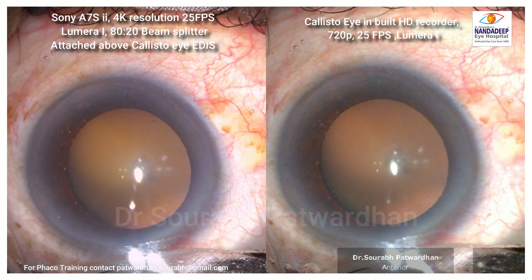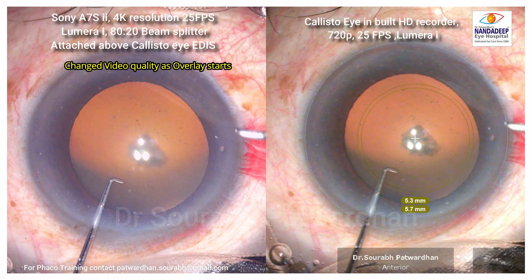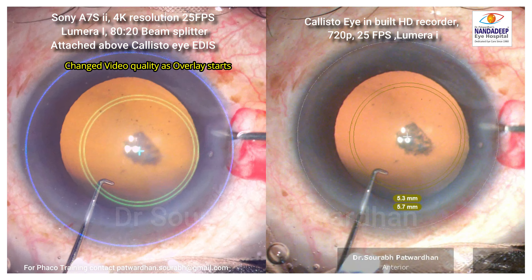On the left side the resolution is better and on the right side you can see a little bit of granulation. The vessels you can see are sharper on the left side. The moment the overlay starts and the EDIS activates, the quality of the 4K camera also reduces.